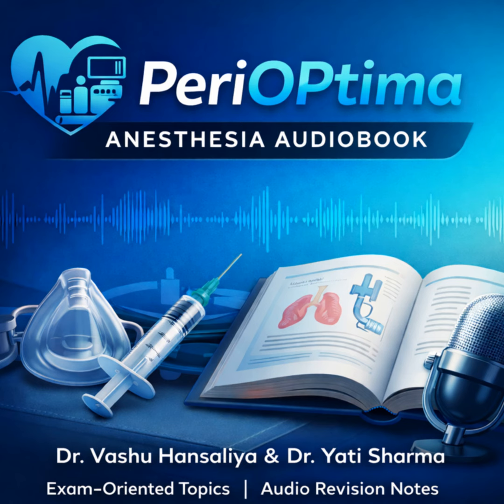7. Railroading is a blind step risking laryngeal injury. 8. Video laryngoscopy offers continuous visualization, mitigating that blind step. 9. ETT tip placement is confirmed visually, 3 centimeters above the carina. 10. Complete airway obstruction requires a surgical approach, not FOI. 11. Benzocaine carries a risk of methemoglobinemia. And 12. If AFOI fails and you lose mask ventilation, move immediately to a rescue invasive airway.